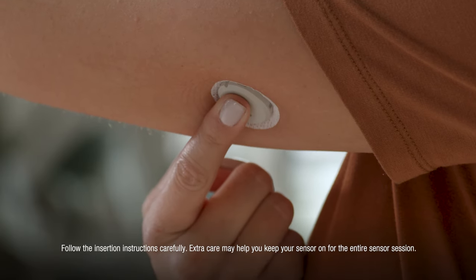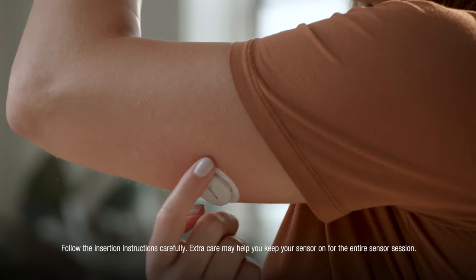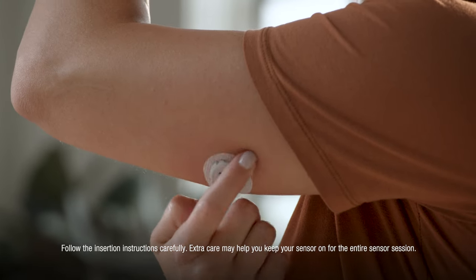To help keep the patch on your skin, press on the sensor for 10 seconds. Then rub around the patch 3 times.